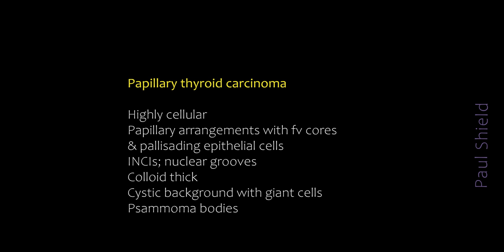Colloid can be present and is usually present in fairly thick blobs. These are usually cystic tumours, so the background will often be full of debris and hemosiderophages and macrophages. And psammoma bodies, which I didn't show you in this case, can be present as well.